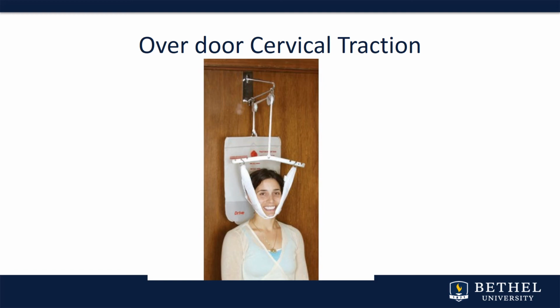This is kind of a funny one, but again, this one was a home unit, an over-the-door cervical traction. However much weight you put in here, that's the amount of pull that will be distributed through the traction unit.